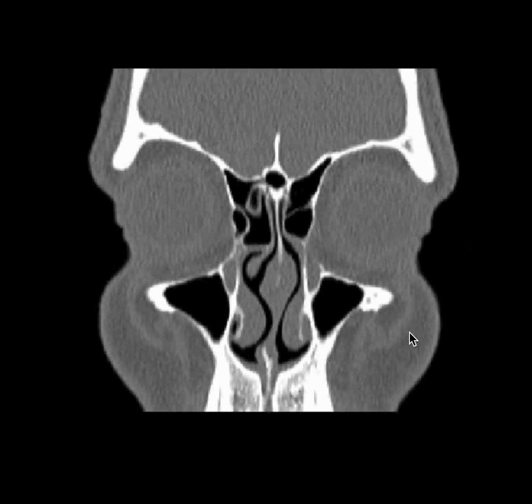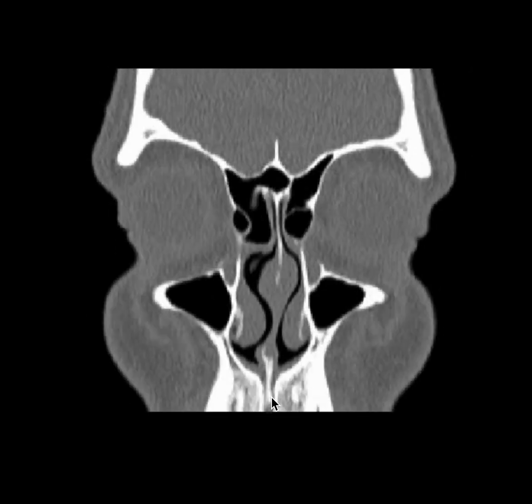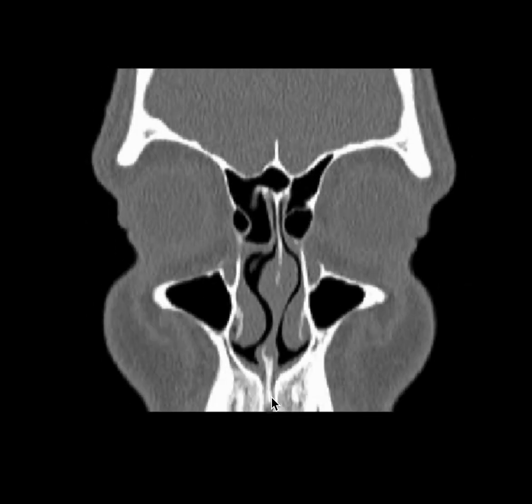The maxillary sinus are seen here and this is the incisive canal where blood vessels and nerves pass, and we can use injections in this area for a nasopalatine block.